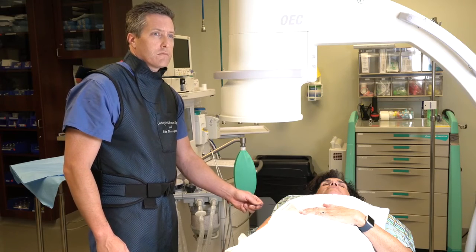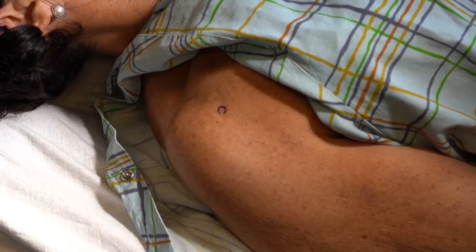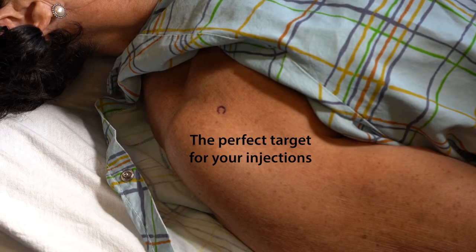Using the C-arm, the metal indicator acts as a guide. Find the injection site and depress the Gentian Violet ink pad, giving you the perfect target for your injections.